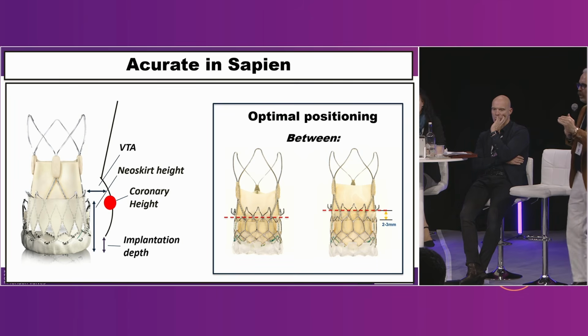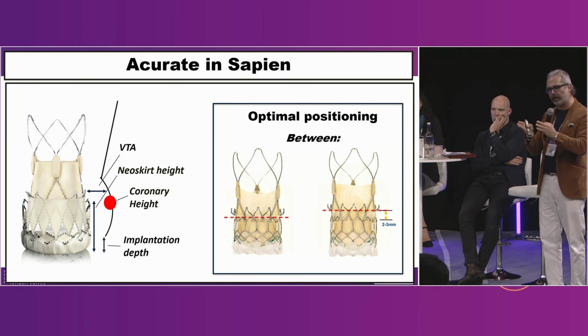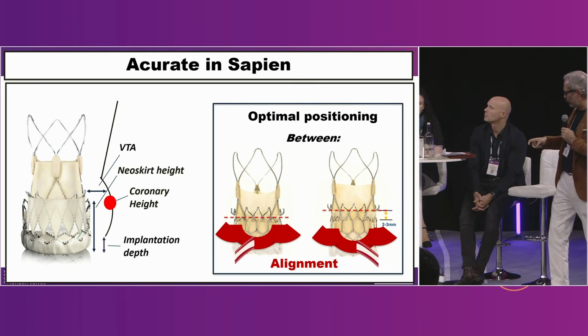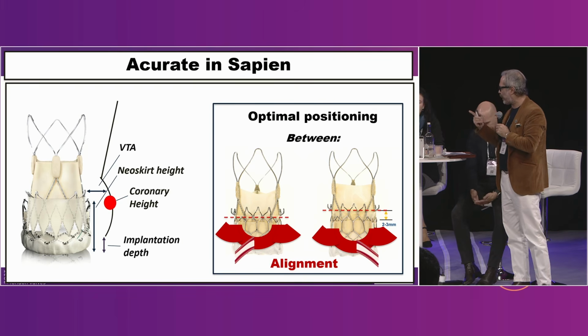Why 2 or 3? Because if you stay 5 to 6, actually you have a billowing of the leaflets in the SAPIEN, and you don't have a clear flip up of the leaflets. So you need to stay maximum at this level to permit the hooks of the ACURATE to stay above and to smash completely the leaflets of the SAPIEN valve. And actually, this is mandatory again, when you go with the ACURATE in SAPIEN, to orientate the ACURATE. This should be a default strategy in case of third intervention.